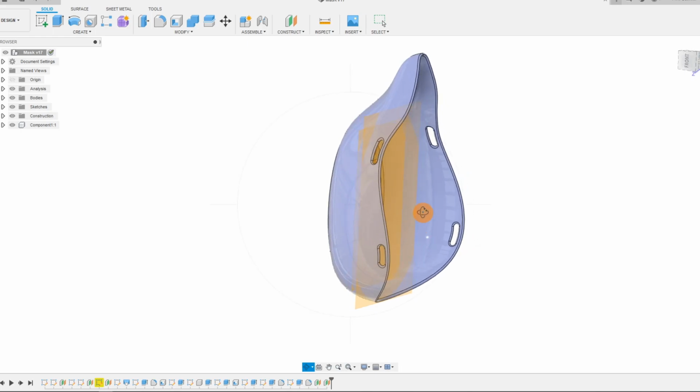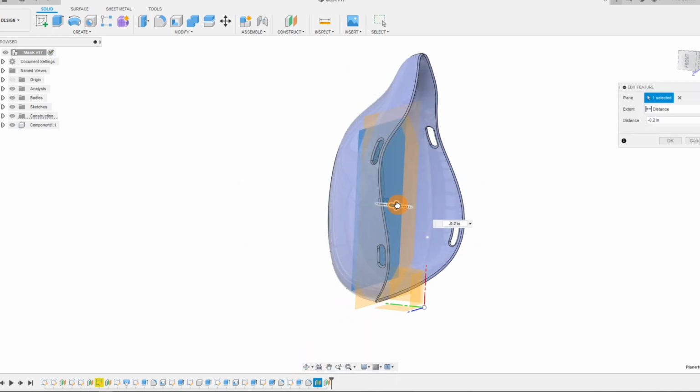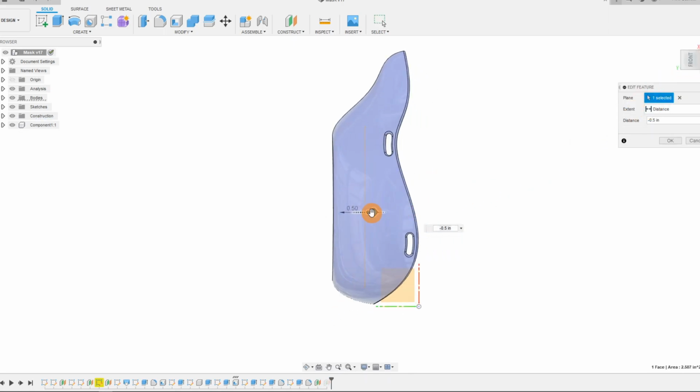We can always modify this. I can always go back and edit this feature and move it a little bit closer here. And I can also move this one as well. So you can always come back and modify it. So I can make this negative 0.4.